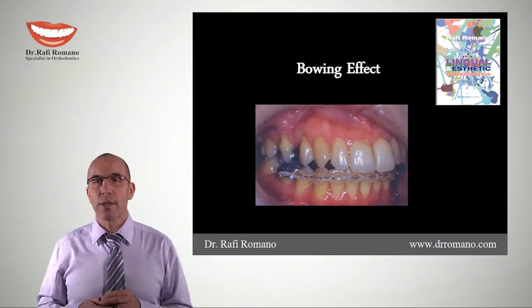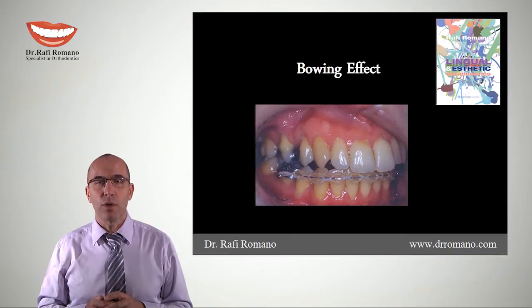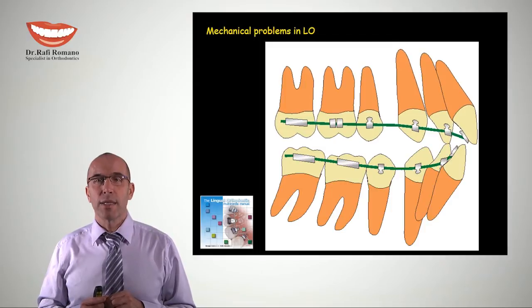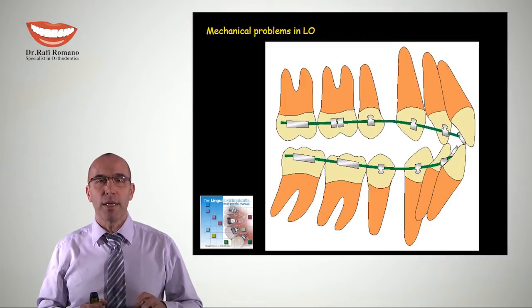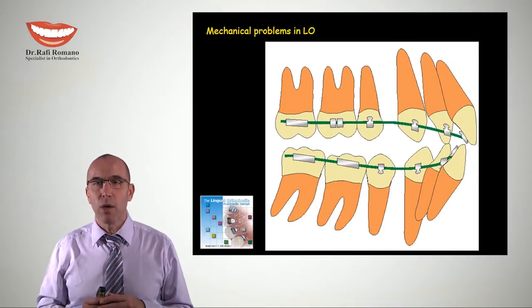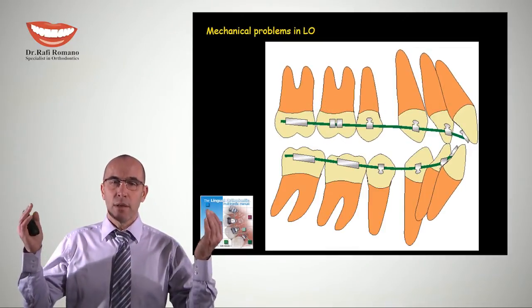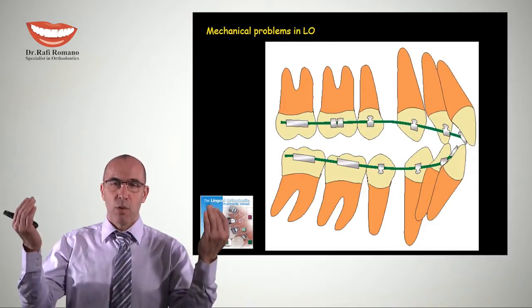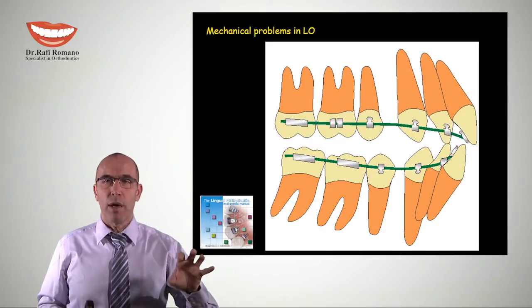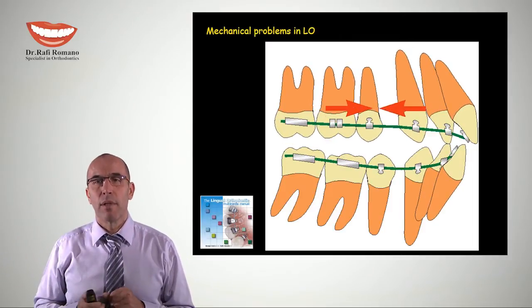You can, of course, see more details on this phenomenon in the book Lingual and Aesthetic Orthodontics, published by Quintessence Publishing. I want to show you a very nice illustration taken from the CD-ROM by my friends Kutsu and Takamoto. This CD-ROM was marketed by Omco many years ago. Now you can see in the illustration what happens when we try to apply force to close space. We apply the force, the wire is bending, we get extrusion of the molar, extrusion of the centrals, and intrusion of the teeth in the middle, the cuspid and the premolar.